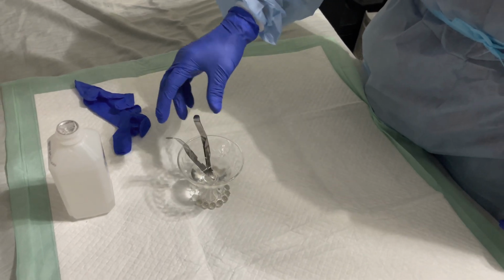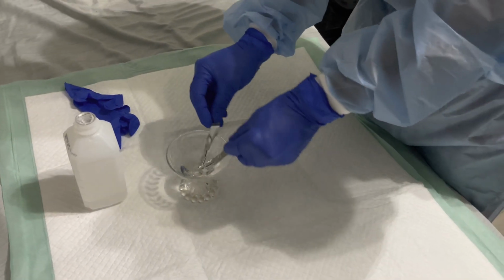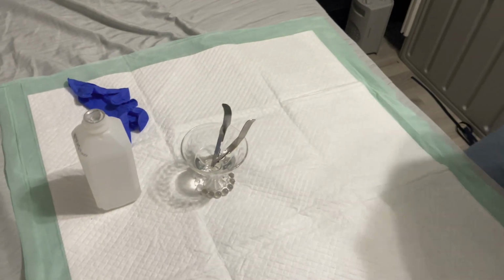You want to put it in some alcohol, preferably 70% or better. Let it sit in there. Maybe move it a little bit to get it in the areas. So we let that sit there while we grab a pup.